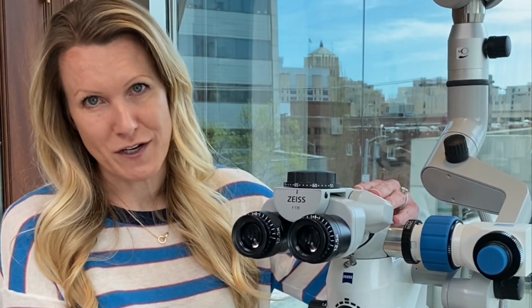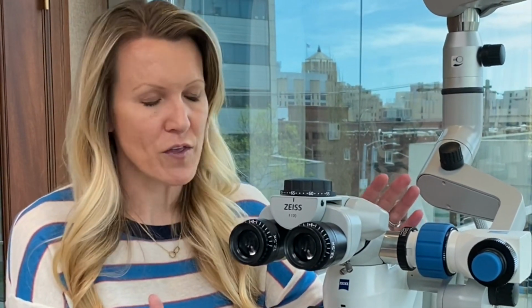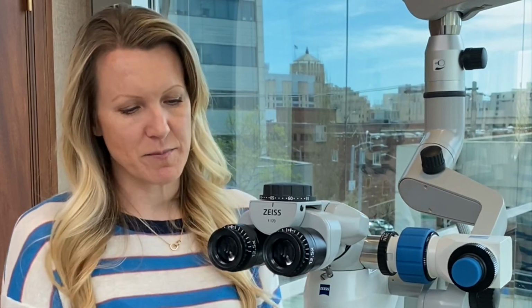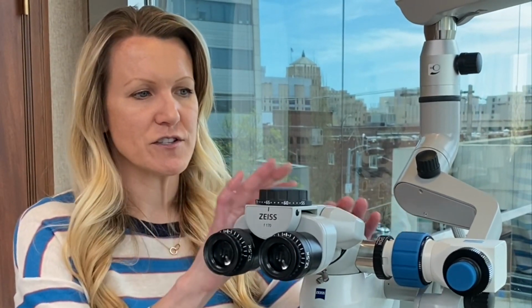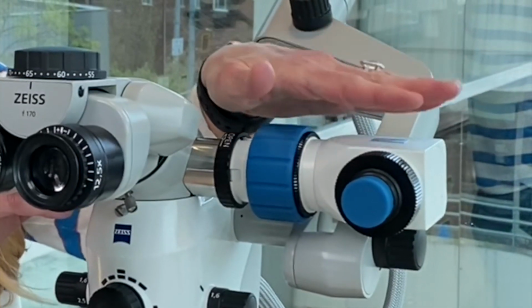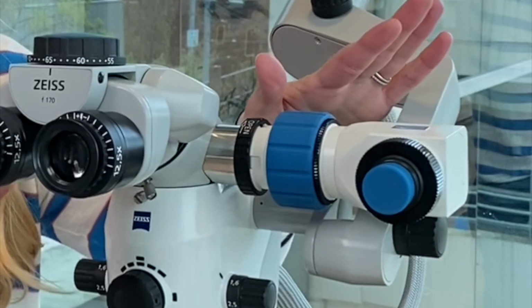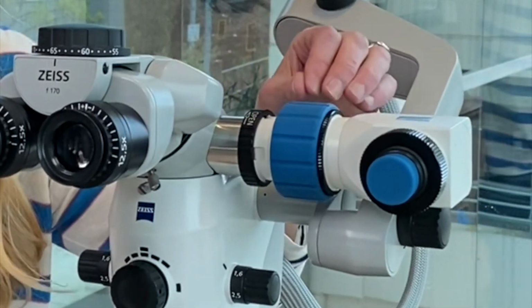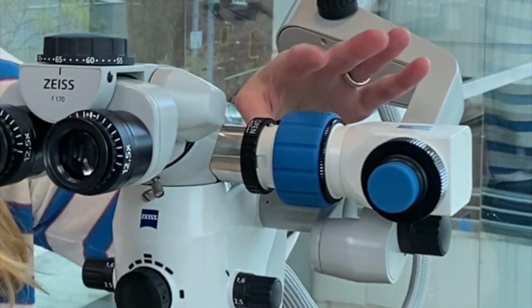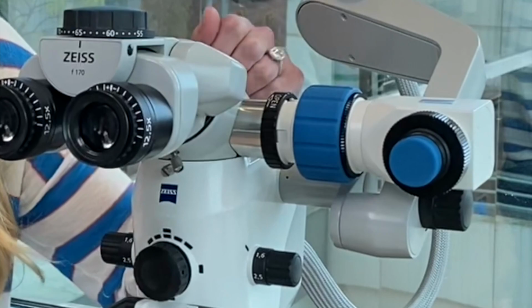This scope does not have a Mora adapter, and the reason why is that I have what's called a beam splitter, and this scope did not allow for me to have both. A beam splitter does essentially what it sounds like. It splits the beam. It splits the image coming up through the objective lens to the binoculars and to some other place. In this scope, I have it going over here to an adapter that allows me to capture images for documentation. So there's all sorts of options on this, and I'm not going to go into it on this video at all, but there's all different options. Usually the beam splitter and the adapters are all specific to the microscope and then to the camera that you're using, and so that's something that we could spend a lot of time on.